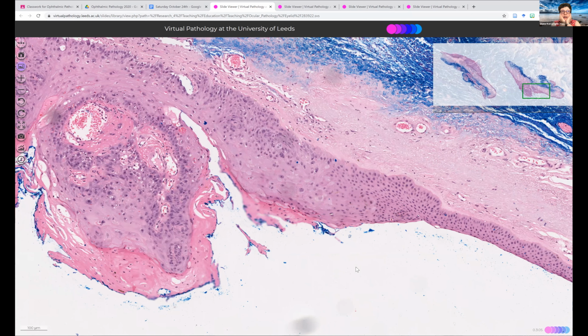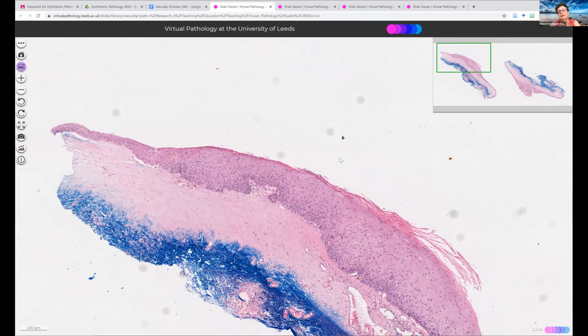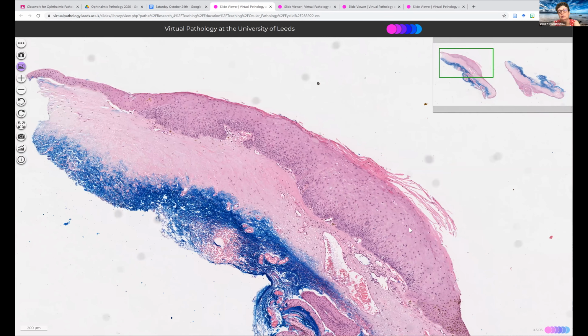Yes, it would. I think it can be graded on both, actually. I think there's probably two. This is a good research topic. I think there are two kinds of high grade in situ OSSN. One is a differentiated kind with really, really severe basal dysplasia, but keratinizing over the top. And the other is the traditional kind where we have basaloid cells going through the full thickness. But that's not been well explained in the literature, so I would just describe it.